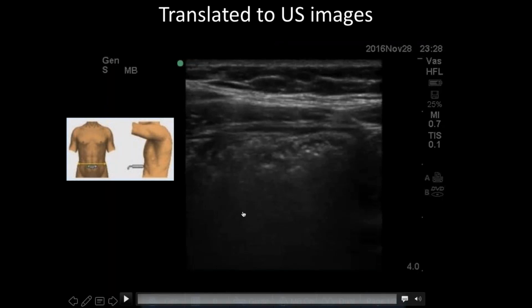We're going to take a look now at the area that I was talking about, the right lower quadrant. So you're going to use the linear transducer and move from right lateral all the way to medial. So this clip is going to show what that looks like as you transition from right lateral towards the medial area, where you're going to go through a lot of relevant anatomy. So skin, subcutaneous tissue, and muscle, and then the intraperitoneal lining right here.